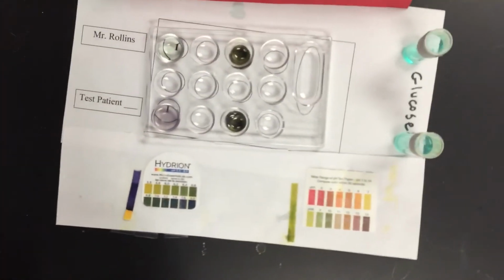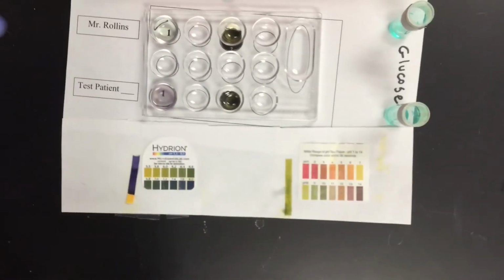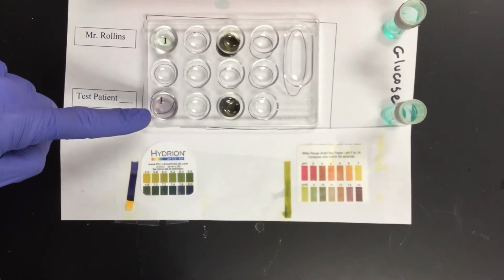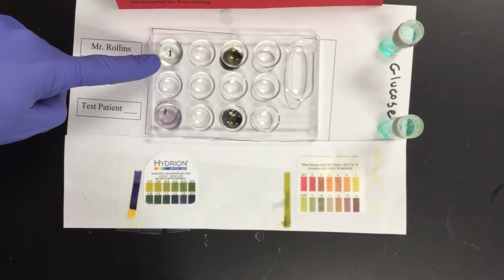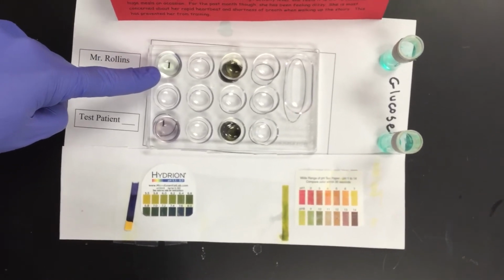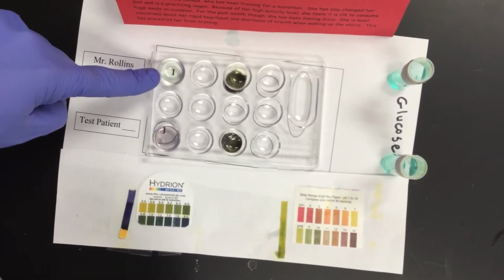Next little bit is protein and chloride. So I gave you Rollins across the top, and I gave you test patient number 18 along the bottom. So here is Rollins for protein, which is well number 1. Here's test patient number 18 for protein. Remember, Rollins is negative. We took our urine, we added some biuret solution, we let it swish around a little bit, and then we let it sit 3 to 5 minutes. There is no color change there.